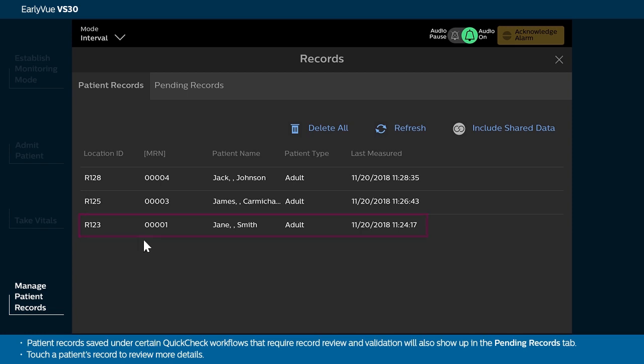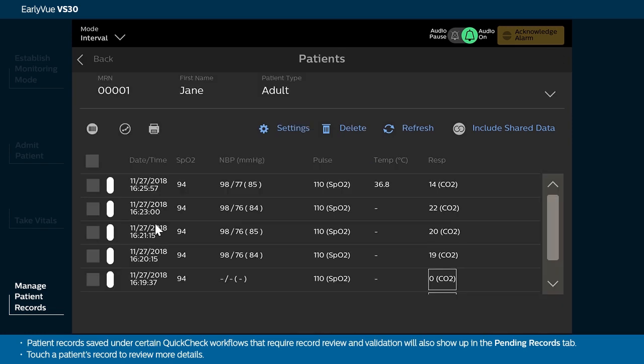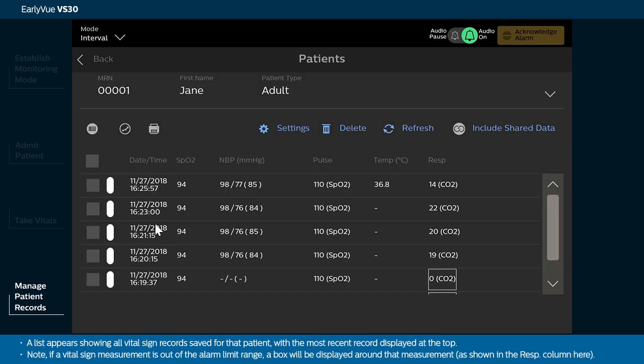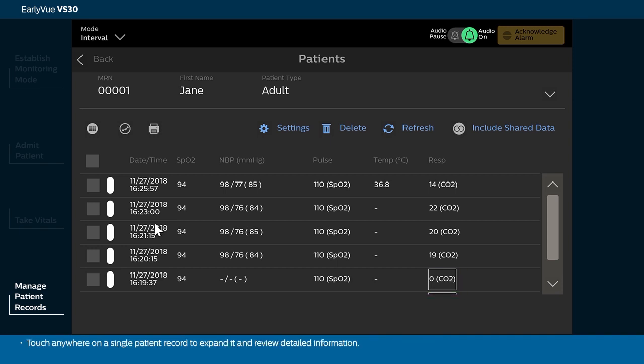Touch a patient's record to review more details. A list appears showing all vital sign records saved for that patient, with the most recent record displayed at the top. Note, if a vital sign measurement is out of the alarm limit range, a box will be displayed around that measurement, as shown in the RESP column here.